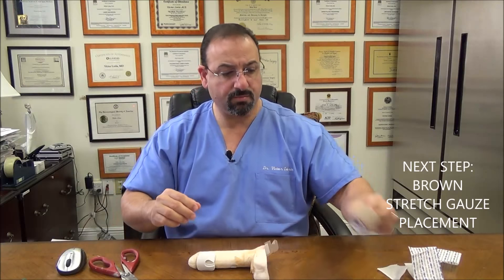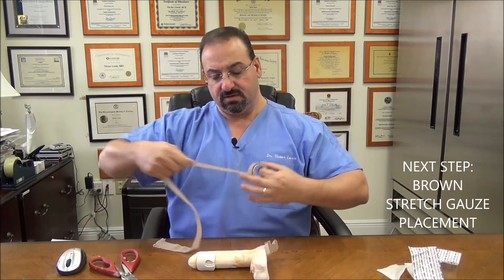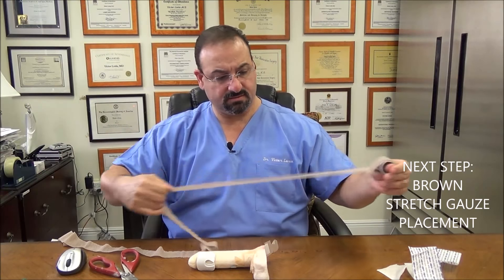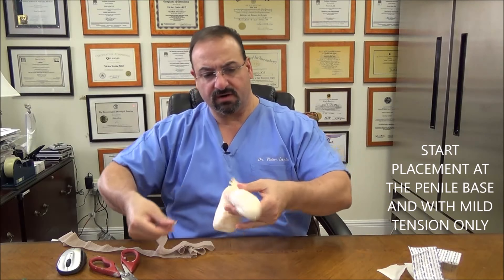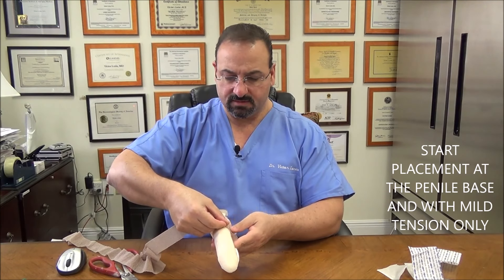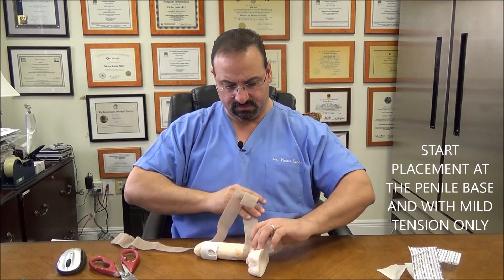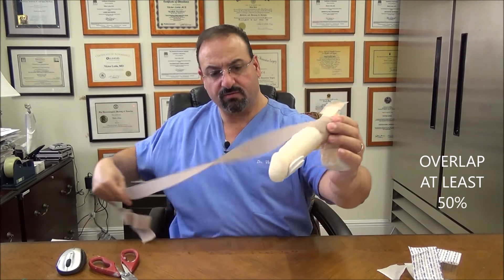Now the next step: take your brown stretch gauze. Take a good length of this — if you take extra, don't worry, you can always cut it. We like to start at the base area and work your way around. Overlap minimally 50%. Let me show you how the overlapping works — that is about 50% overlap.